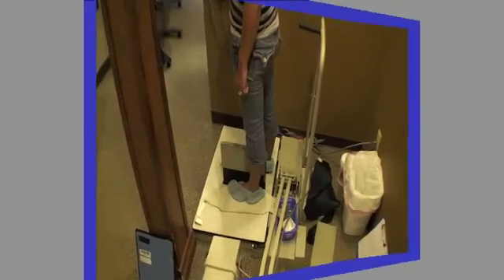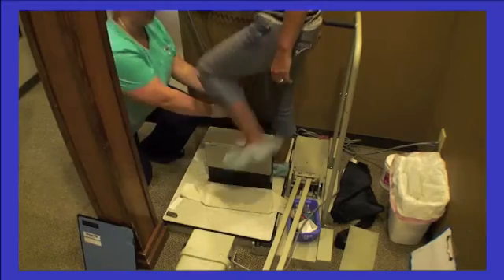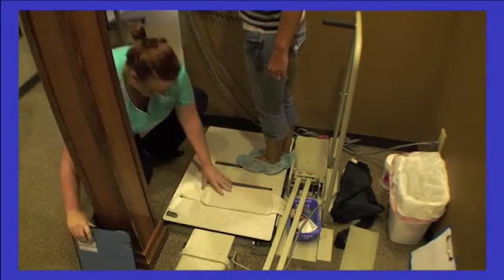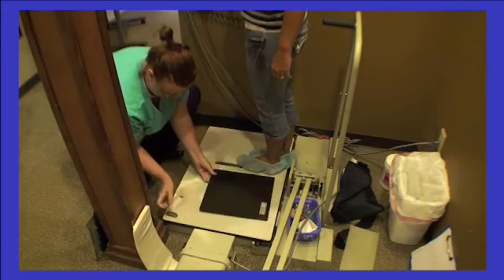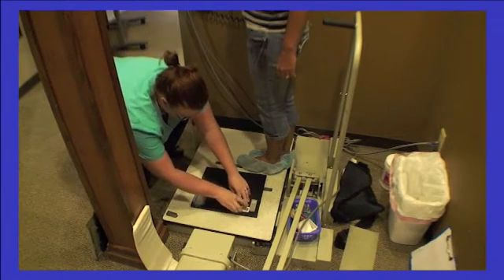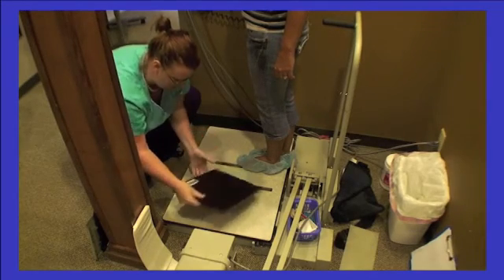To do this, you will position the cassette on the platform, much like an AP, except you will turn it long ways to you. Position the patient in the same way as taking a lateral. Have them stand directly on top of the cassette with their foot in the center. Make sure you place your patient label and left-right indicator on the cassette in the same format as the AP.